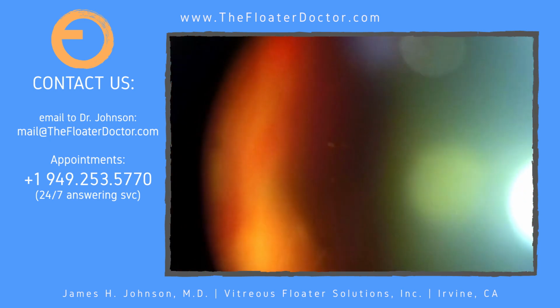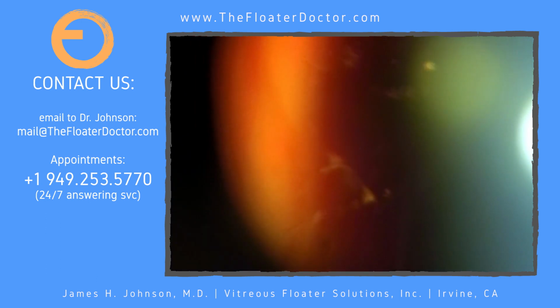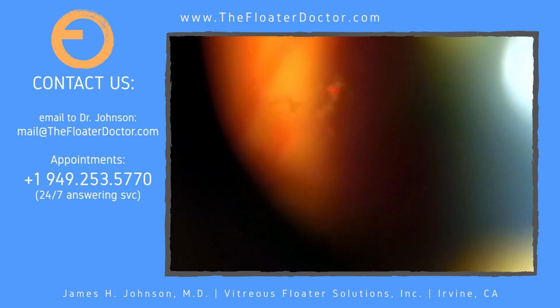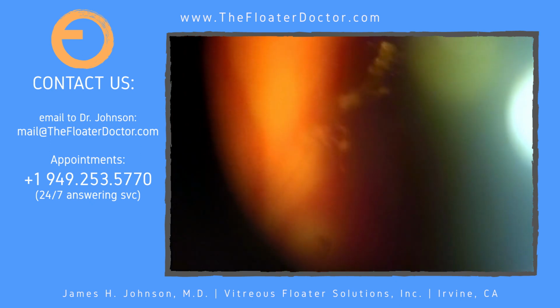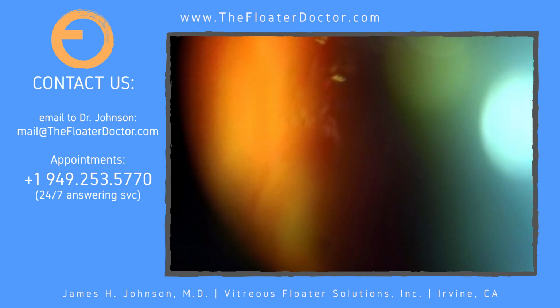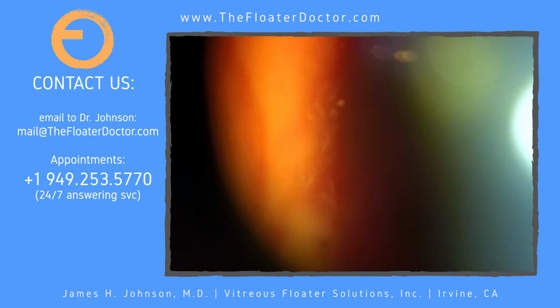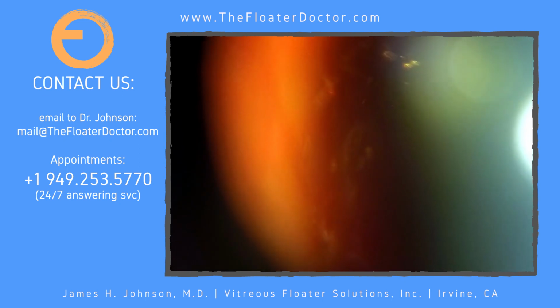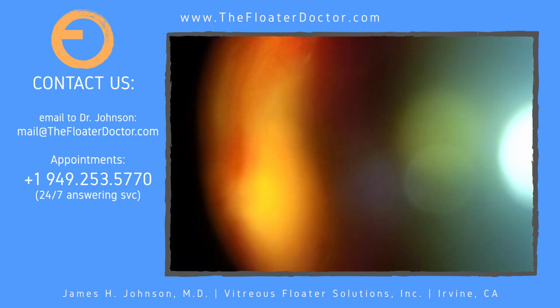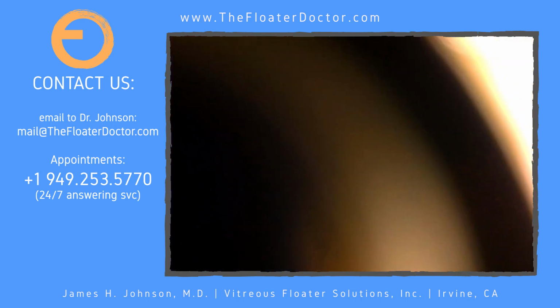Back to light. Okay, look to your right, then far left, and then right again, and then back to light.